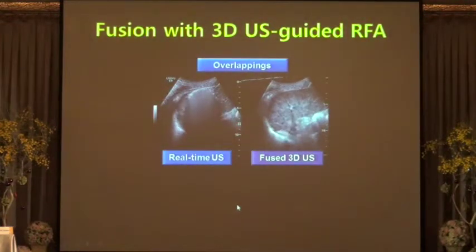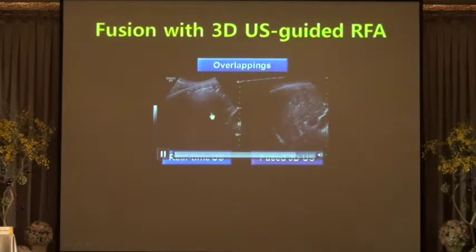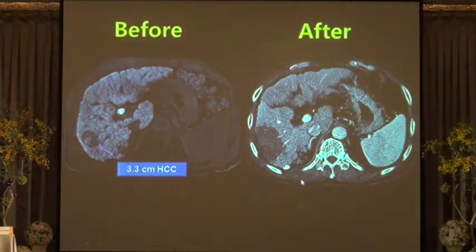Multiple overlapping ablations were performed. Now, the echogenic zone seems to be large enough to cover the entire tumor, and the immediate post-RFA CT scan shows that it was a technical success with sufficient ablative margin.